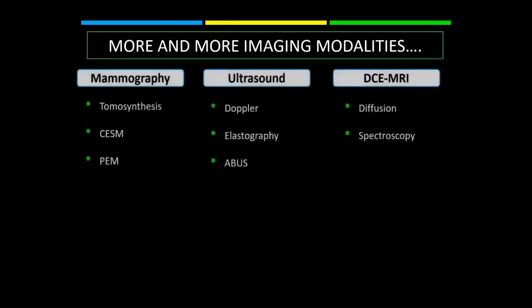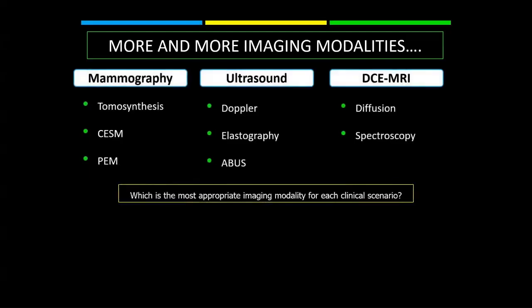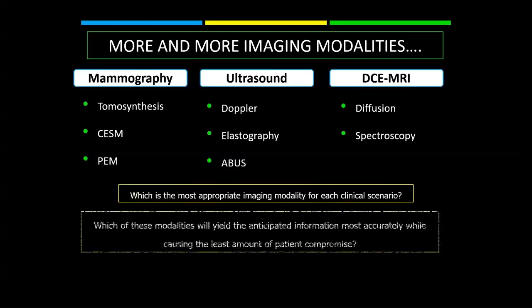And now that we have more and more imaging modalities in hand, it has become a real challenge to choose which is the most appropriate imaging modality for each clinical scenario. And it has become a challenge too to choose which of these modalities will yield the anticipated information most accurately while causing the least amount of patient compromise.